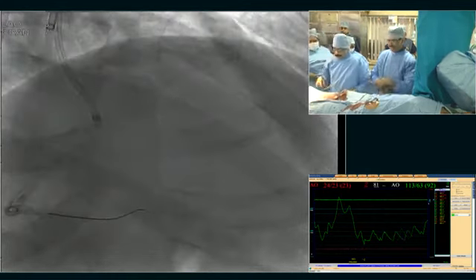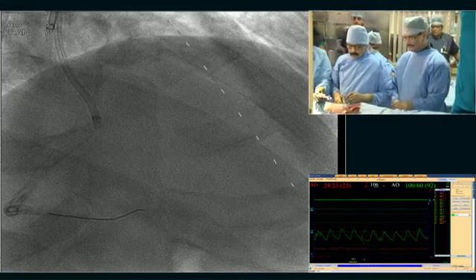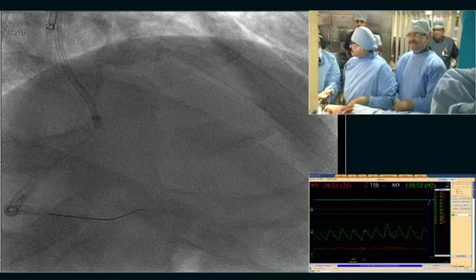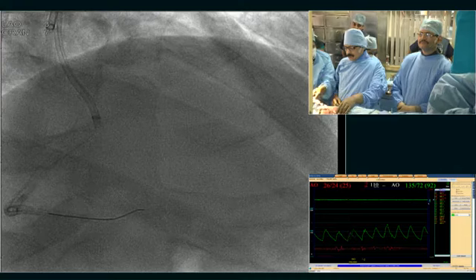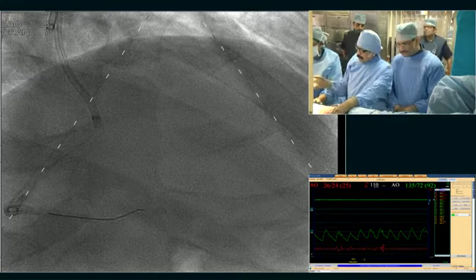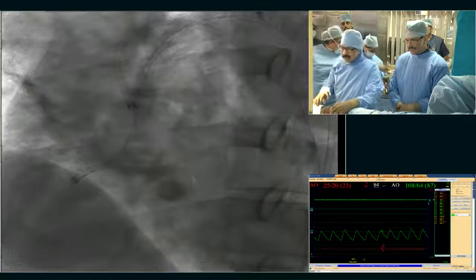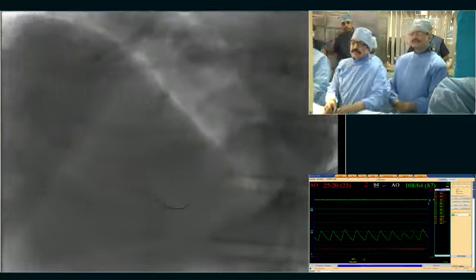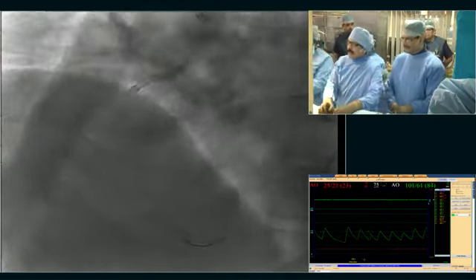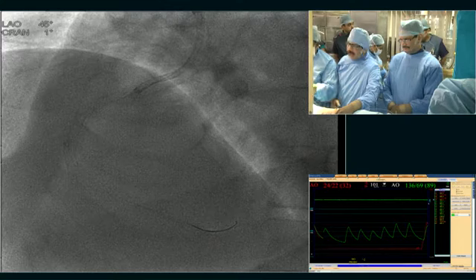Okay, so we take a Crusade catheter. If time permits, we'll enter the LAO, please. Crusade with Sion, I think, antegrade. And what will be your wire inside the Crusade? Already this is a Sion there. We'll put a Sion to cross the posterolateral branch. I prefer a Sion wire. I will see. Go to the LAO cranial.